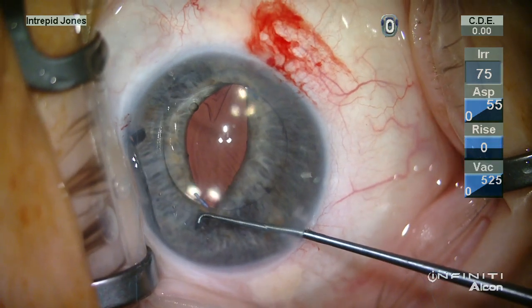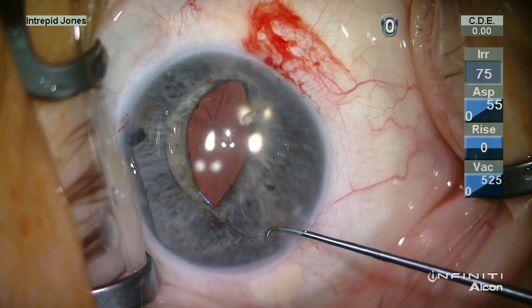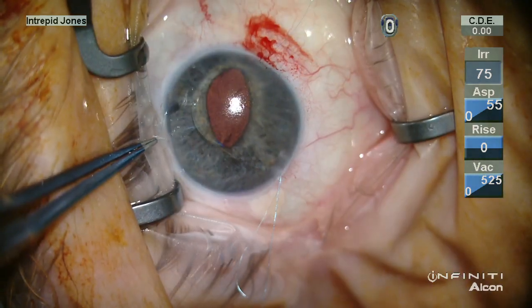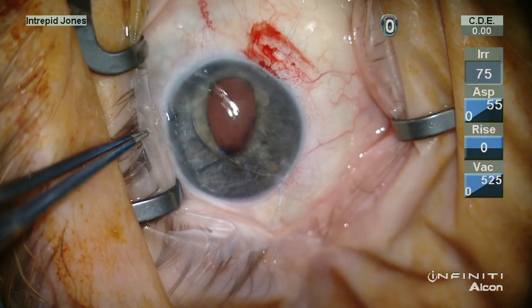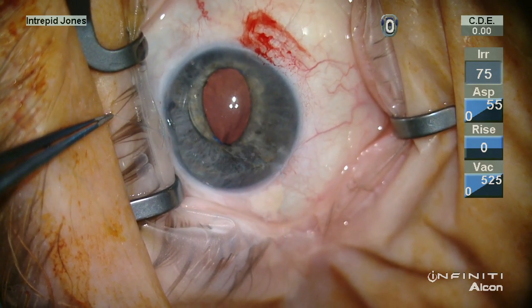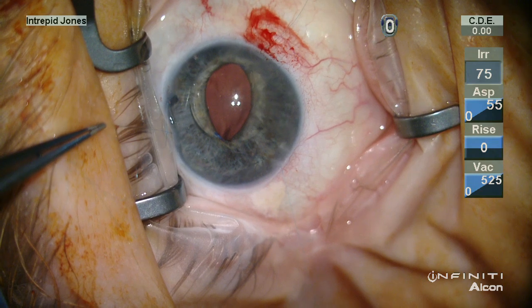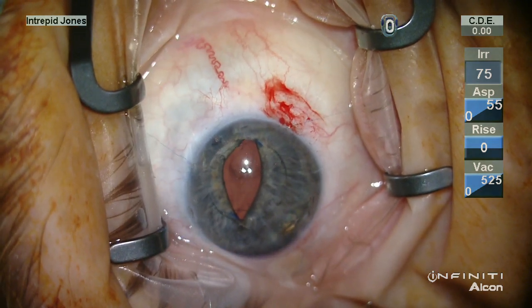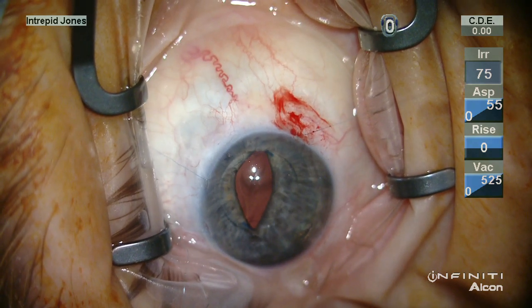A sliding knot is then fashioned by retrieval of a loop and three throws are placed, and then the knot loop is brought into the anterior chamber by pulling on both sides of the suture without tensioning the suture into the iris and haptic at this time.